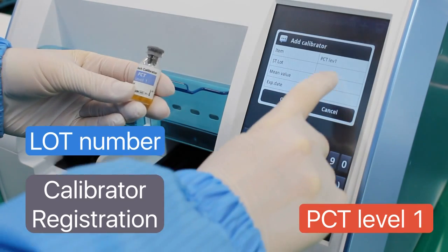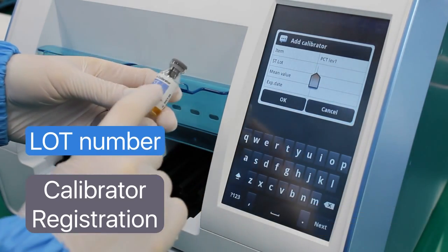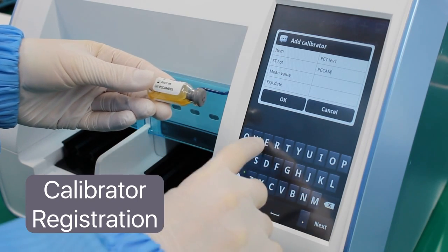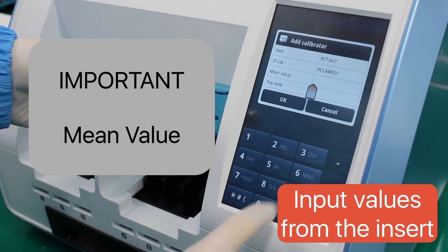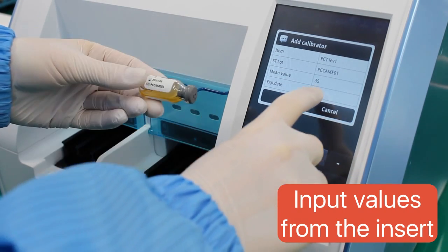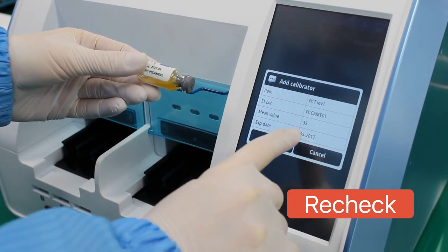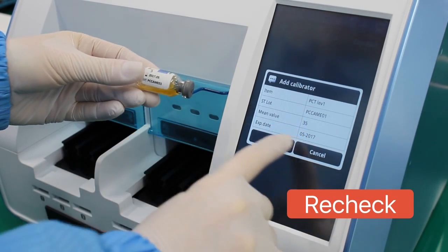All the information needed to register both calibrator levels is indicated on the product label as well as the value insert. Make sure that all information is accurate.